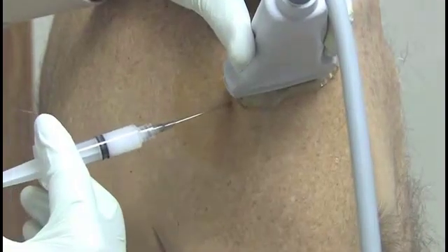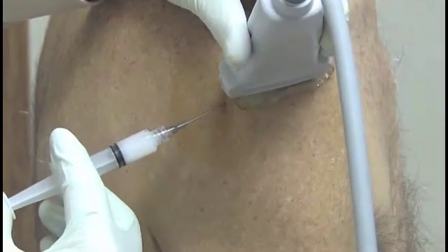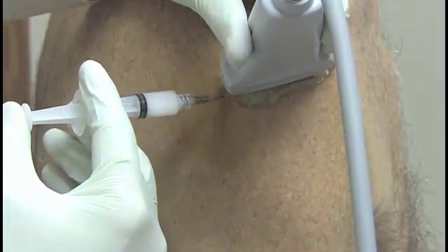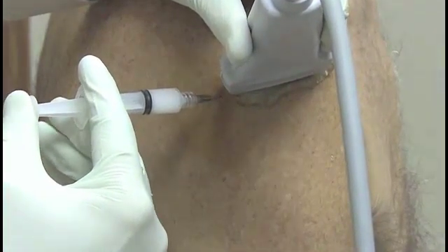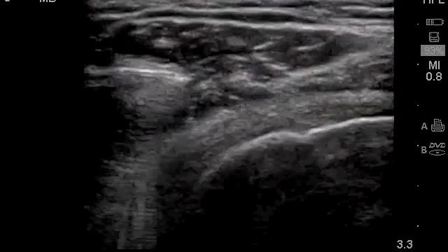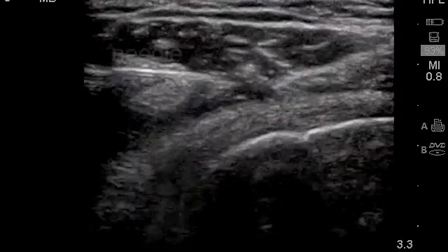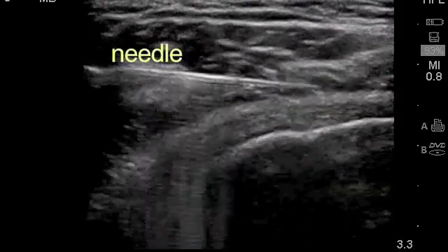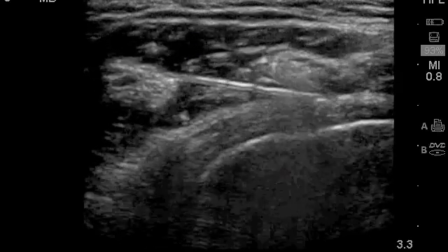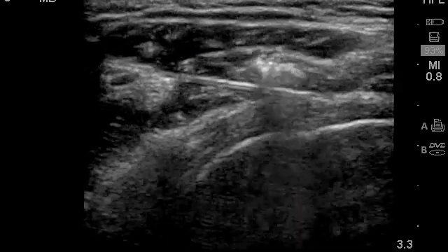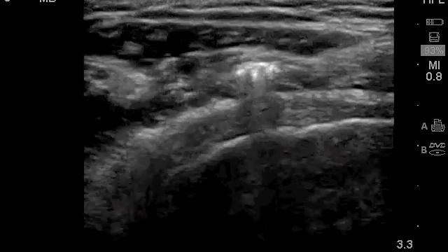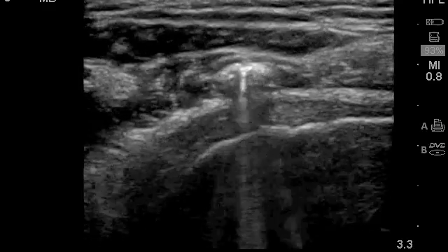The needle is inserted along the edge of the ultrasound transducer and directed in a plane parallel to the long axis of the transducer. The needle will be visualized as a hyperechoic line as it advances in plane with the ultrasound beam. Diffusion of a steroid suspension can be visualized and will appear anechoic with hyperechoic foci due to its crystalline structure.